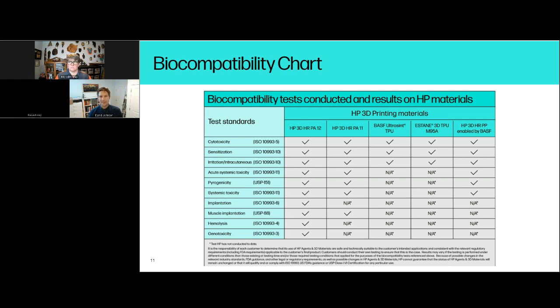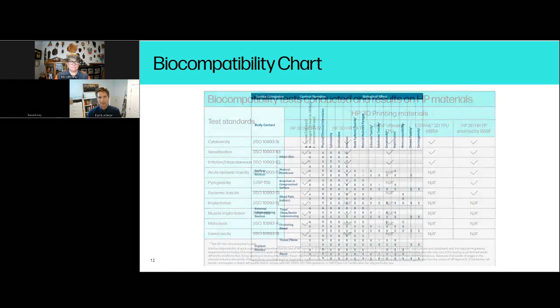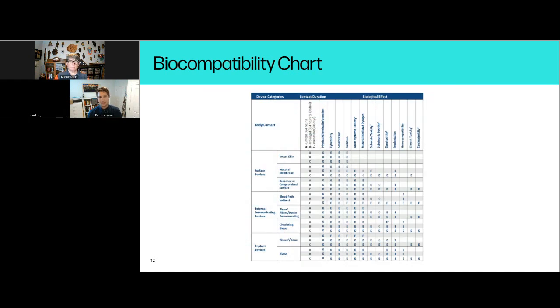All right, sounds good. And then the other chart that is pretty critical, at least on the FDA side, is this one, which is available on their website. Meredith, do you want to just explain what this is and how it can dictate the testing requirements, but also the actual design planning as you're trying to see what best material to choose from?